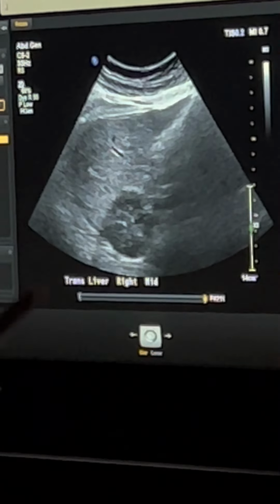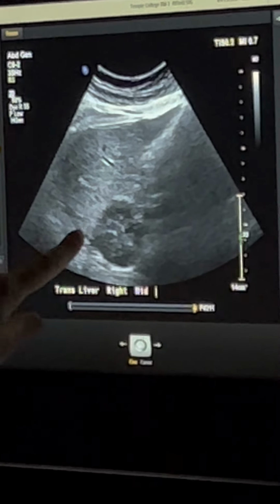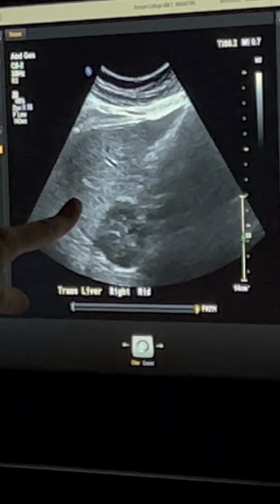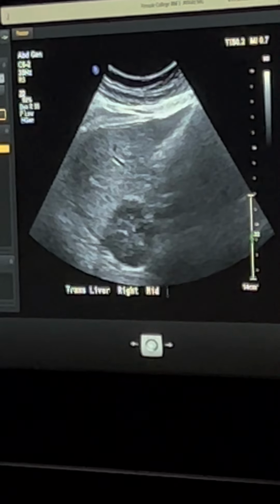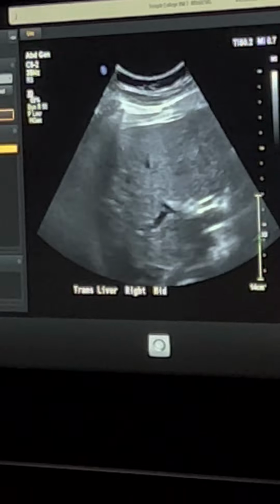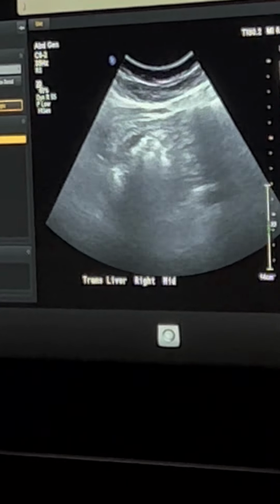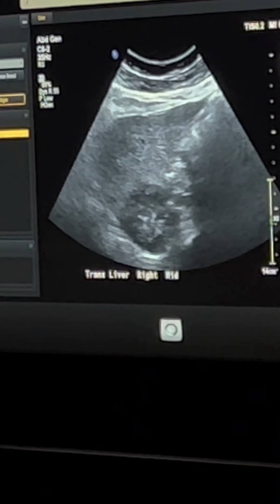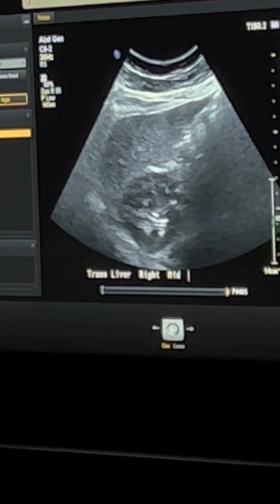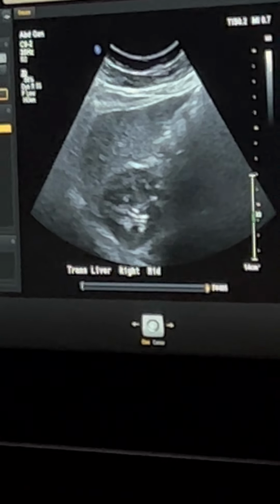Breathe. This is kidney, okay? This is liver, inferior. So that's gonna be your landmark, okay? Deep breath. But make sure again that you're scanning all the way through and back in. Breathe. Inferior, okay?